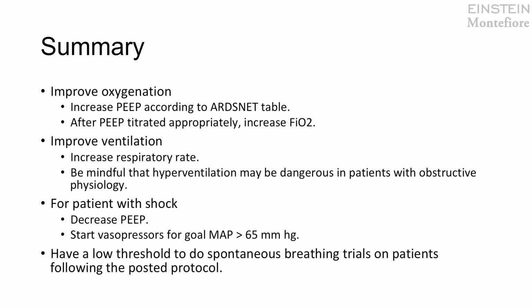And then, of course, have a low threshold to do spontaneous breathing trials on patients every single day that they're intubated. They should always be assessed every single day. And for further information on this, you can look at the slides from this lecture, as well as the pulmonary protocol listed on the Department of Medicine's website.